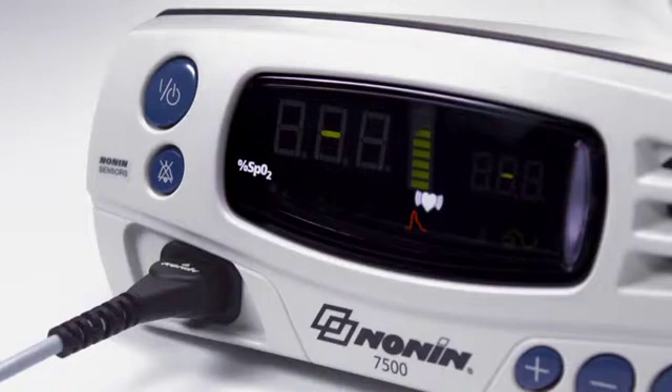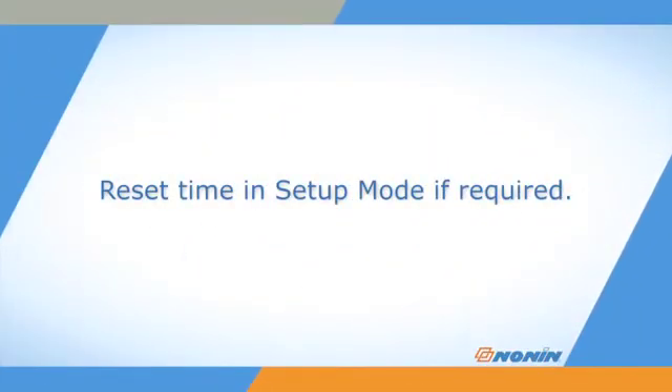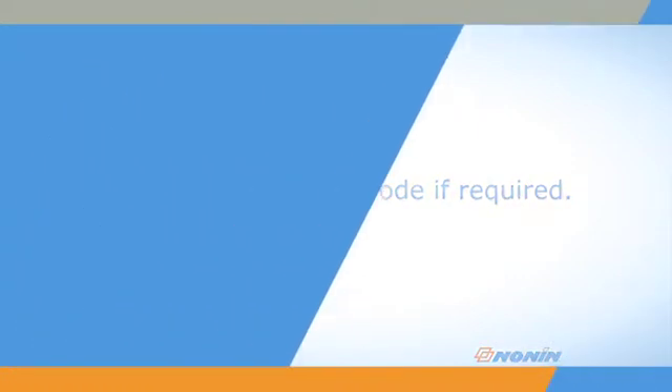If alarms are enabled, they will remain silent for two minutes at start-up to allow time for sensor placement or setting adjustment. Check the oximeter's time settings for accuracy during start-up and reset the oximeter in setup mode if they are not accurate or appear as zeros.